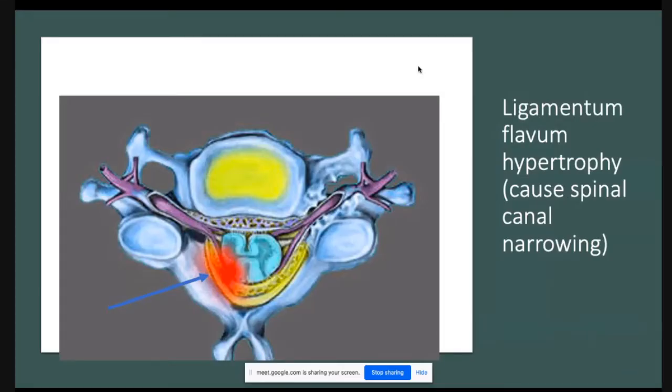So this is what happens. The yellow colored arcuate line is called the ligamentum flavum. It has hypertrophied and it is giving some pressure, or it is narrowing the canal of the spinal cord, and hence there may be a chance of nerve pinching. Nerve irritation, in MRI language, is called pinching of nerves. So this will lead to a symptom. This awareness you can give to the patient.